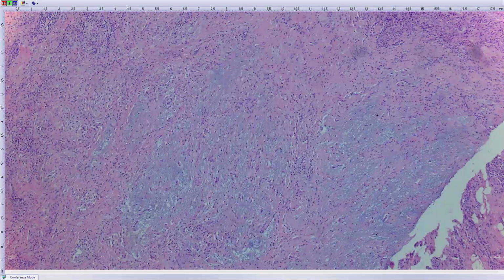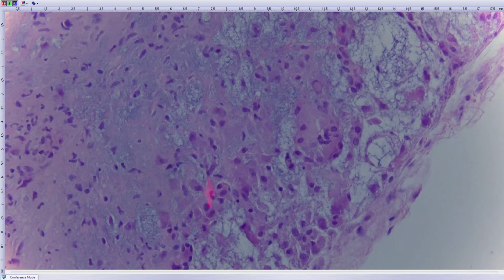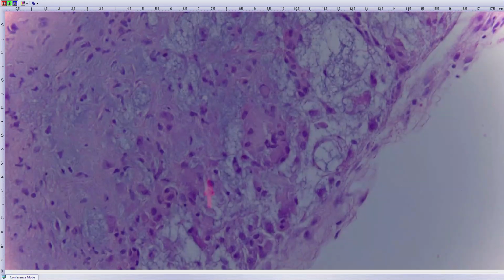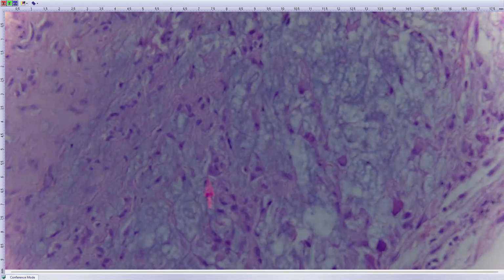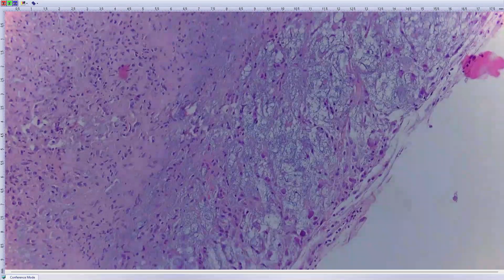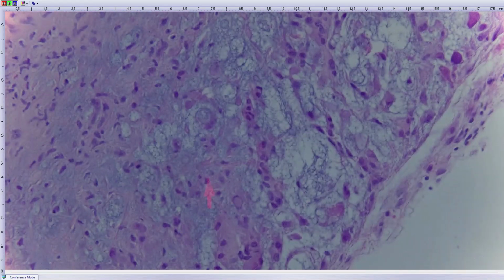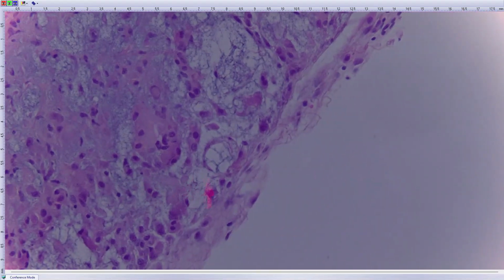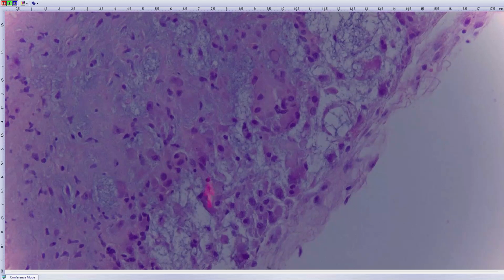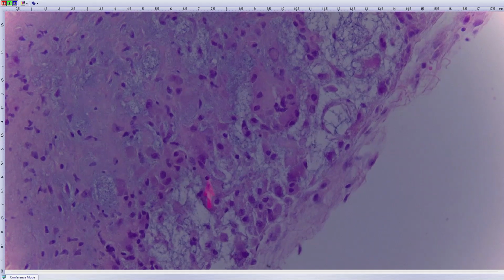Again, a highly infiltrative, inflammatory lesion, but don't dismiss these myxoid areas. They're the clue for the diagnosis, and these areas are actually the best. Again, cells with prominent so-called virocyte-like nucleoli, at least some of them. You can see here, maybe. Yeah, then in these myxoid areas, the mucin gets inside of some of the cells, which are then vacuolated like this. They are sometimes compared to soccer balls or lipoblasts. And sometimes you can see emperipolesis, which is like an ingestion, where the tumor cells eat the surrounding inflammatory cells, and the inflammatory cells are in the cytoplasm.